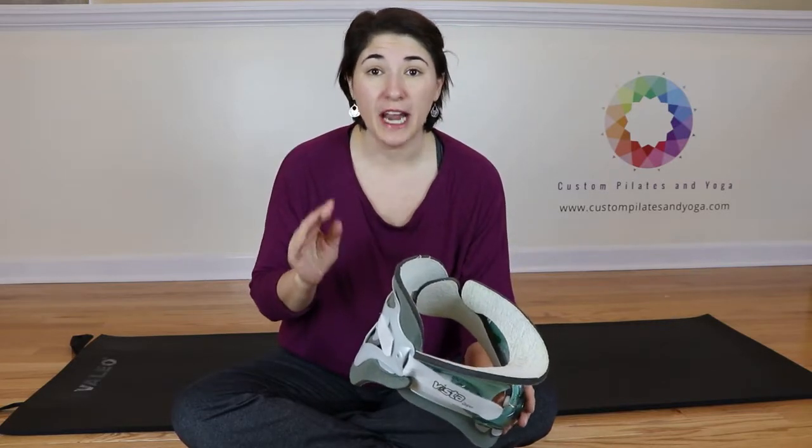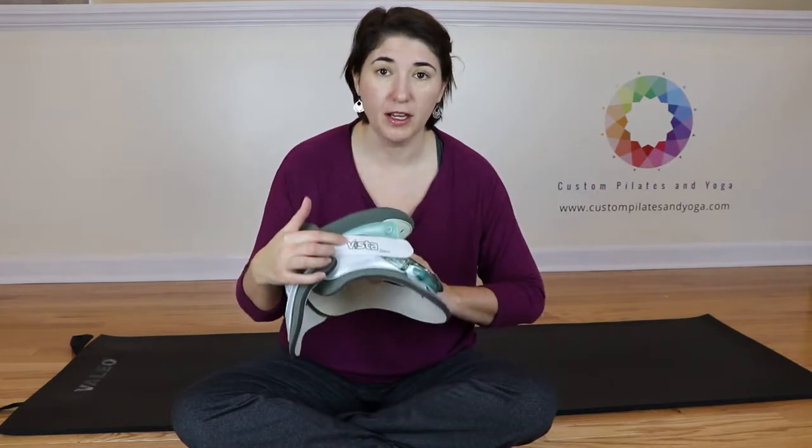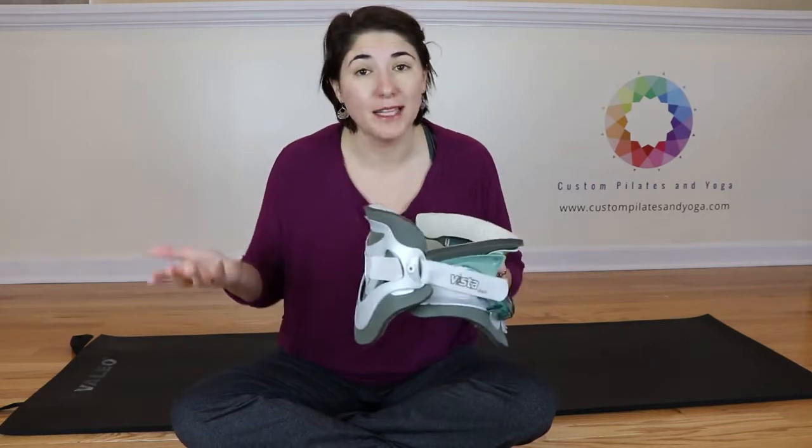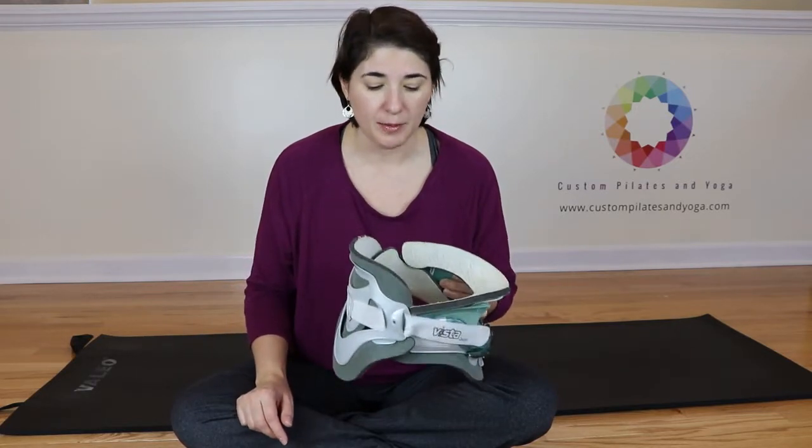However, if they haven't, check what kind of neck brace you have and go on Amazon. Lots of times you can find replacement neck pads on Amazon.